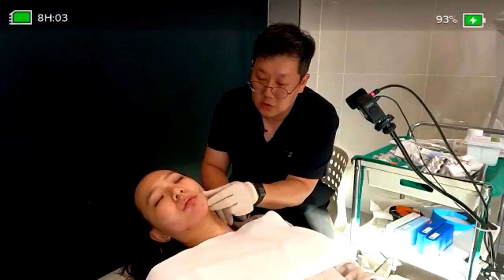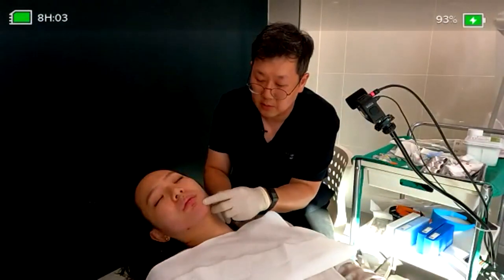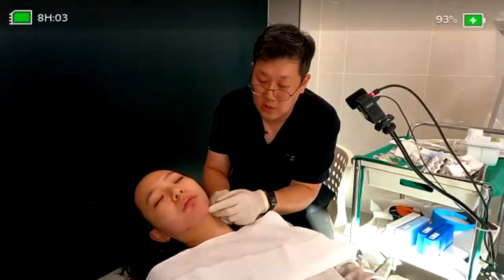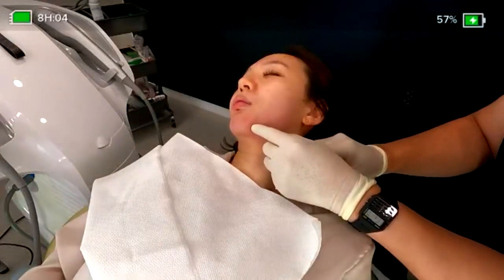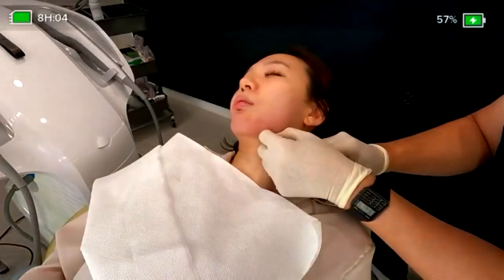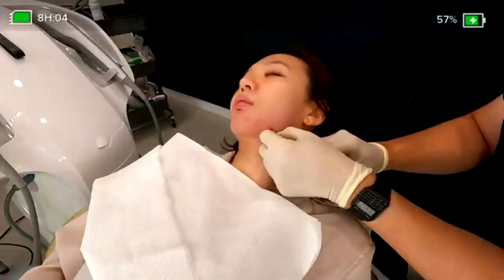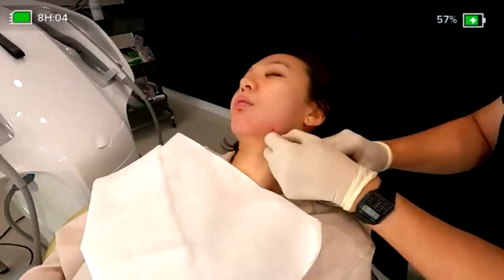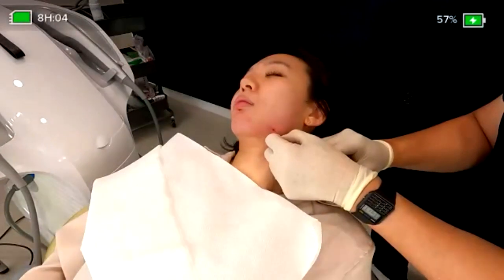Once again, we can just make a touch of the fingertips and go forward with this kind of front injection. Usually you can see how we can handle this cannula motion. Most importantly, if you are not using a constant motion, it is not possible to make the proper injection with the same amount. So please check the speed and the amount injected. Okay, great.